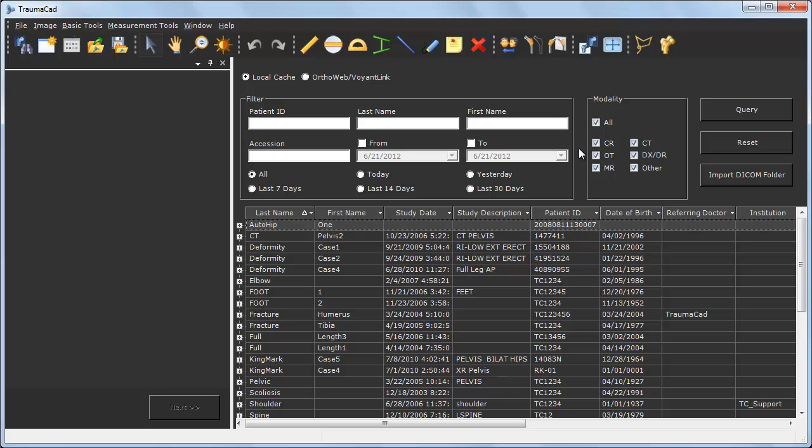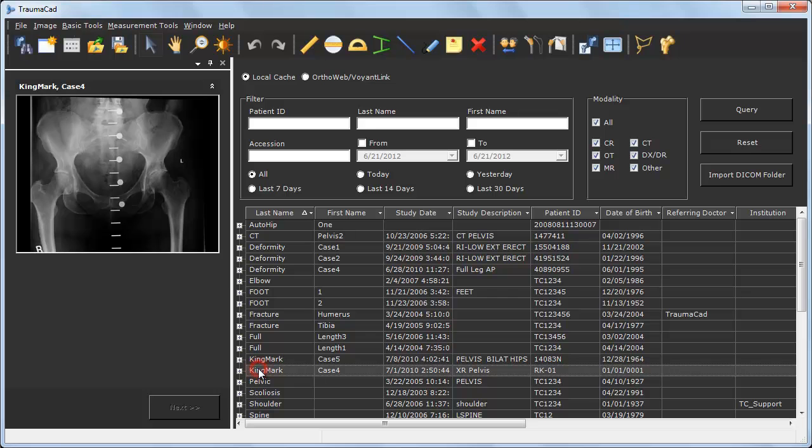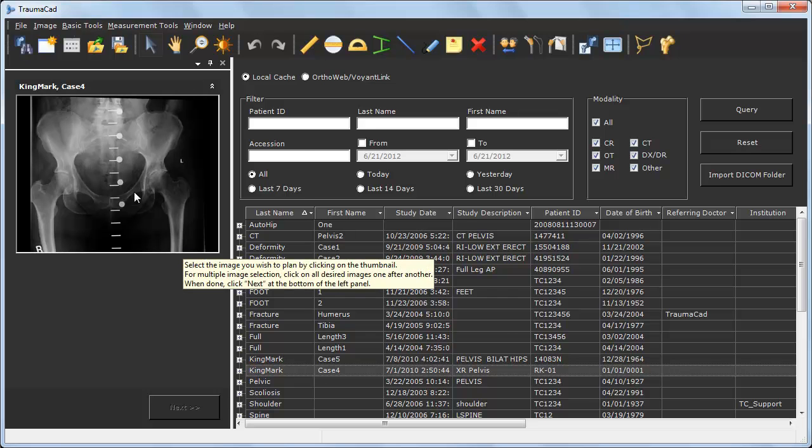To get started, you can simply select any image from the PACS or any other local storage, and you are ready to go.